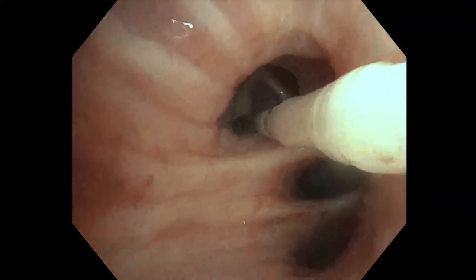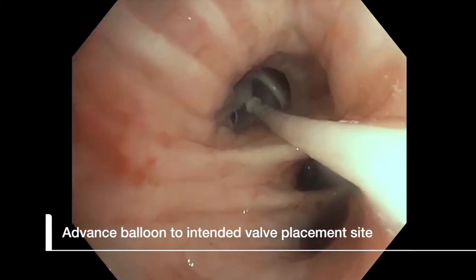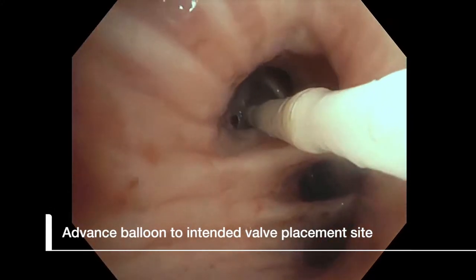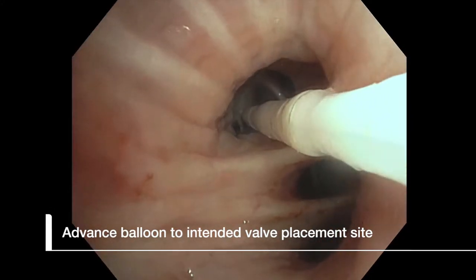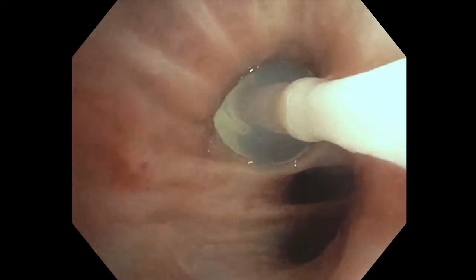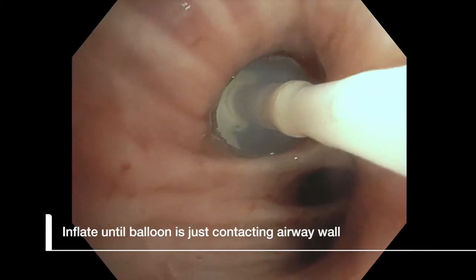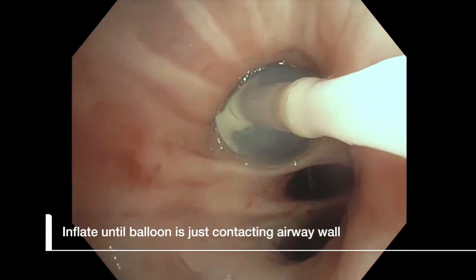Advance the balloon into the target airway, aligning the middle or waist of the balloon with the intended valve placement site. Inflate the balloon until it is contacting the entire circumference of the target site.